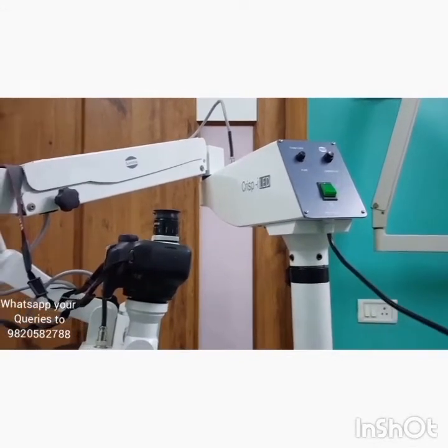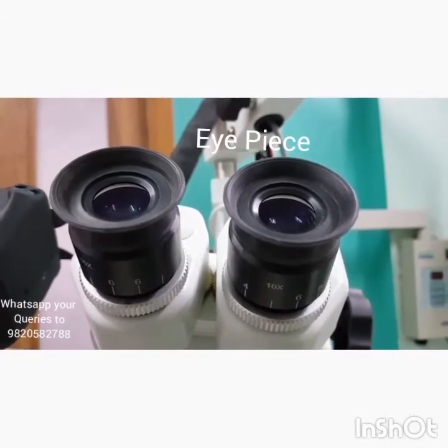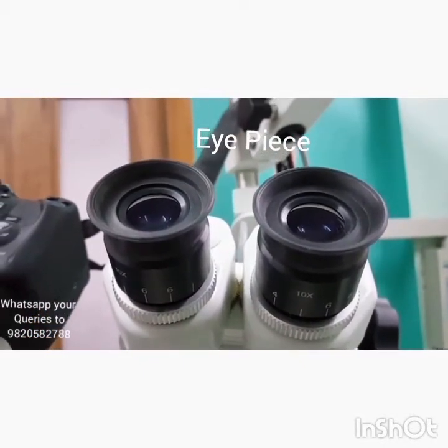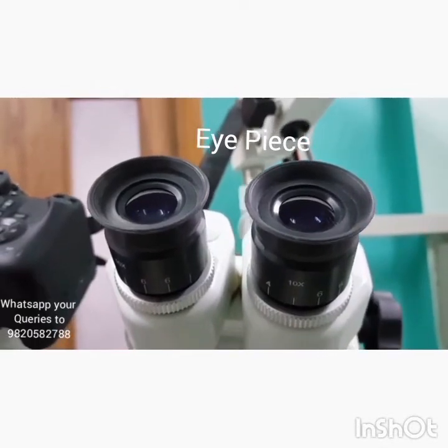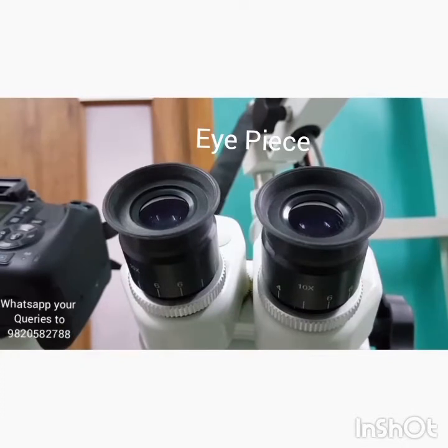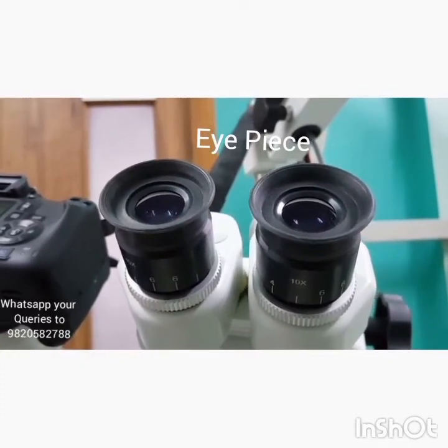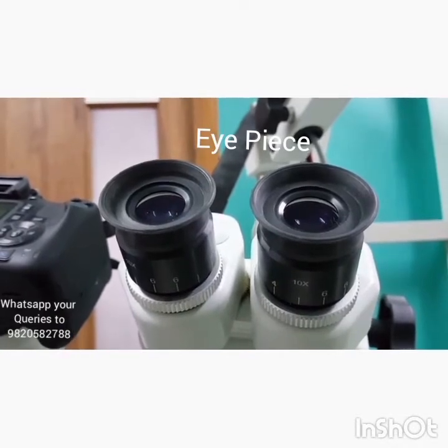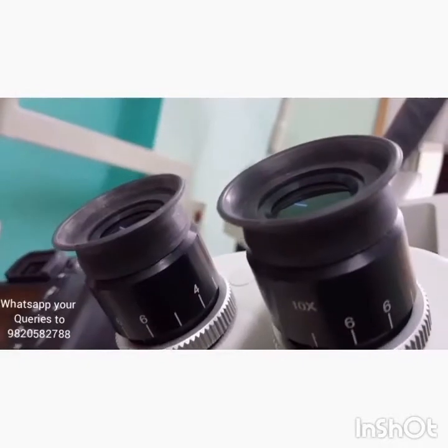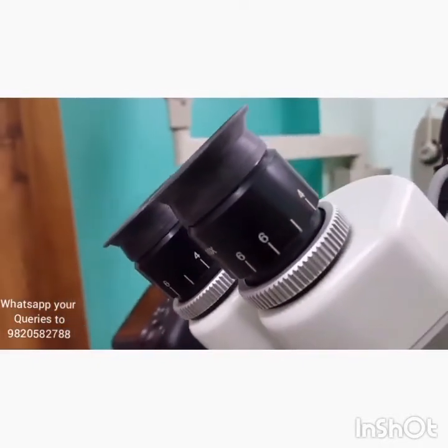During the entire operative procedure, the operator looks into the microscope through the eyepiece. The eyepiece is designed in such a way that the operator can comfortably place his eyes in the designated place. There is a provision for adjusting the diopters and also to adjust the inter-pupillary distance.